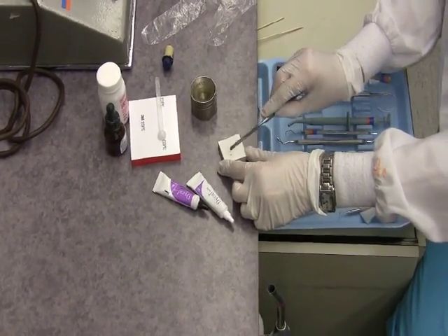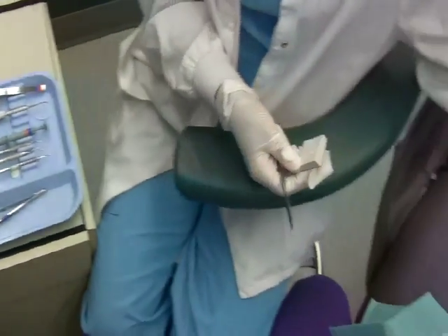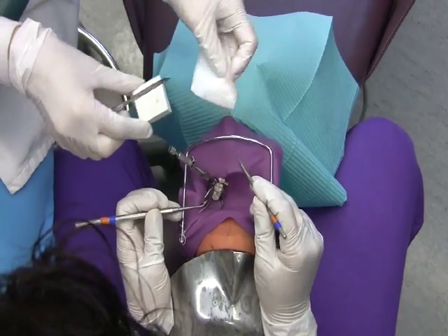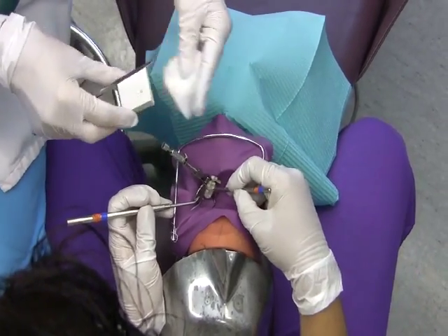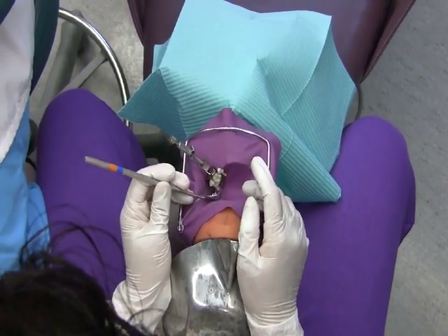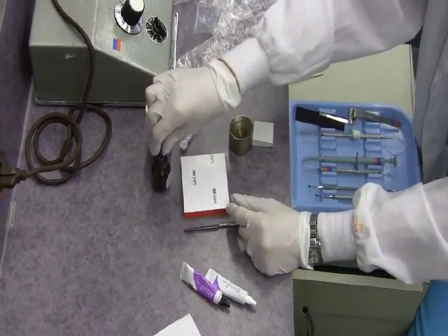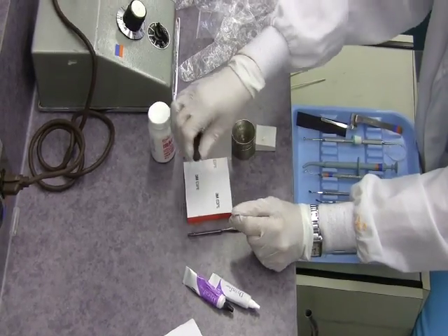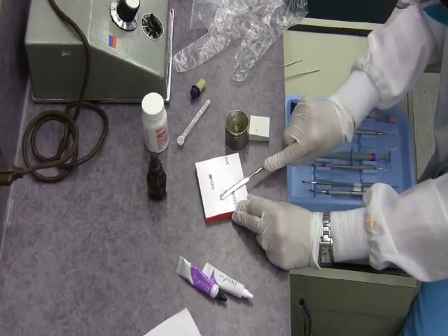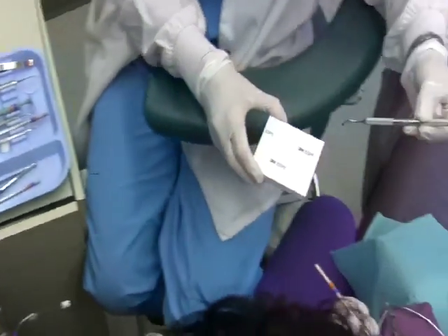So, I'm going to pretend that I'm mixing. I pass the Dycal applicator. Hold this near. Very good. Now, I'm going to mix the base. In this case, we're going to use IRM. One scoop of the powder, one drop of the liquid — I'm just pretending. Then, I'm going to mix the IRM. It has a good consistency. Then, I'm going to pass the IRM to the operator with the amalgam condenser.